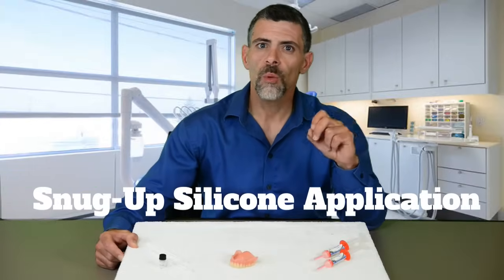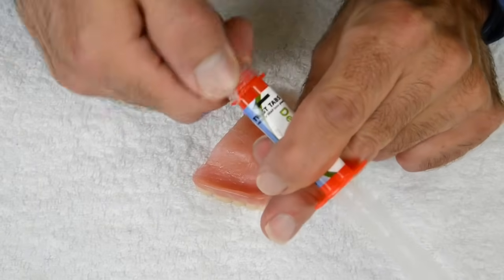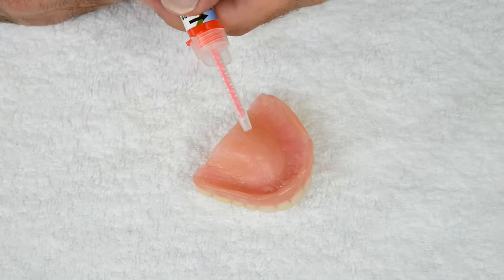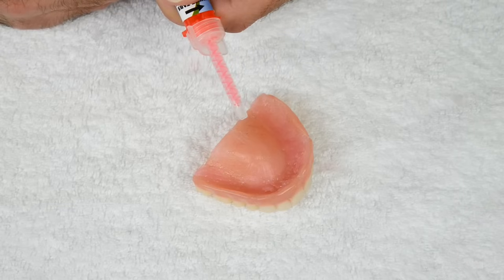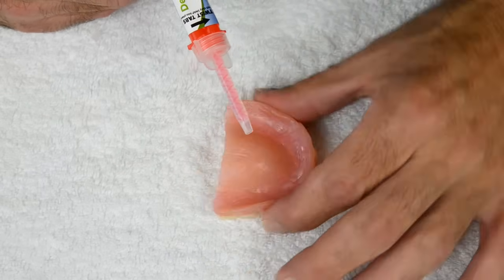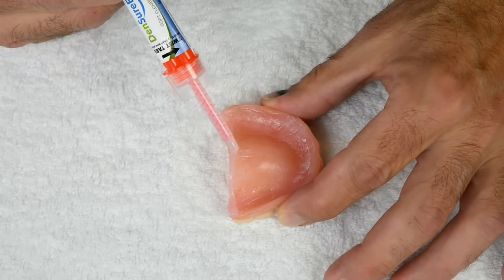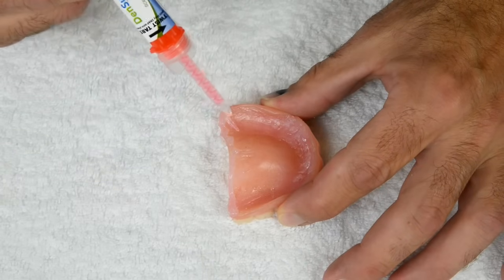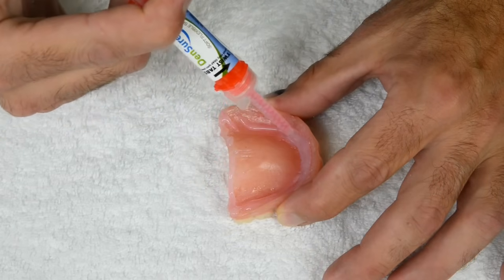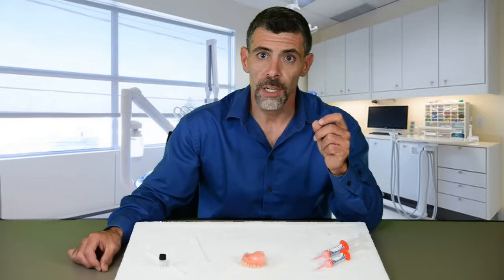Now let's learn where you will apply the silicone for the snug-up. First, I'll explain, then we will do it together. If there are any bare spots along the back edge, apply a skinny line of silicone on those bare spots — remember, the skinnier the lines, the faster the silicone will set up. Then put all of the remaining silicone in the middle of the wall. You will not put any silicone on the palate.